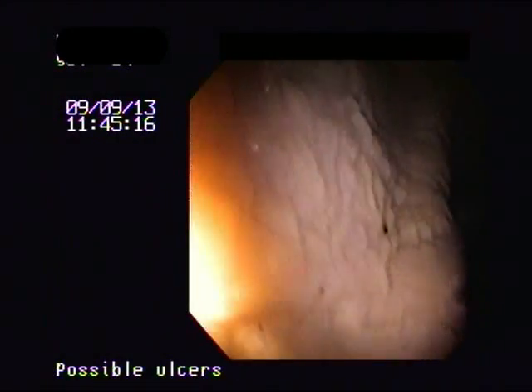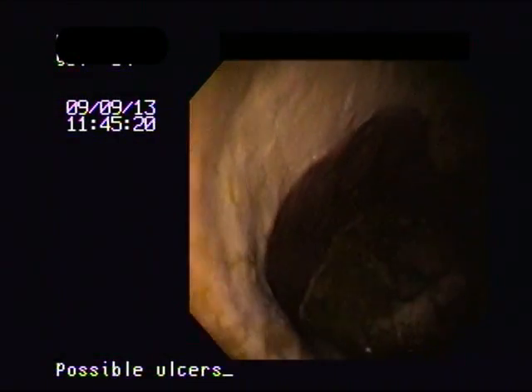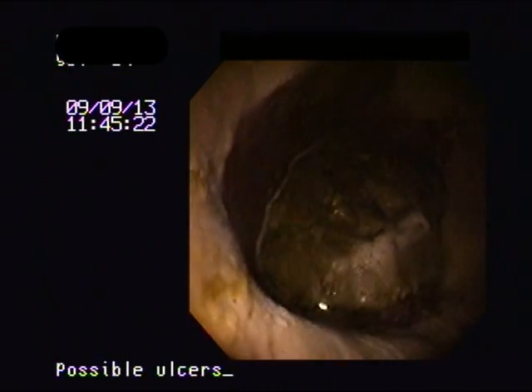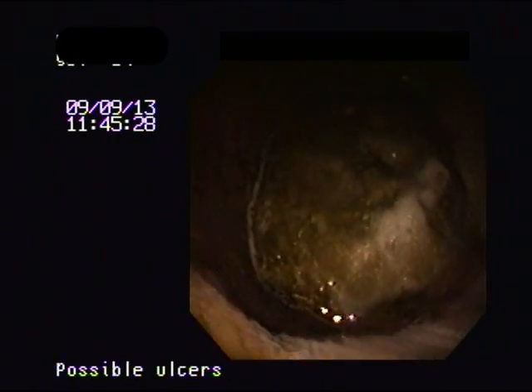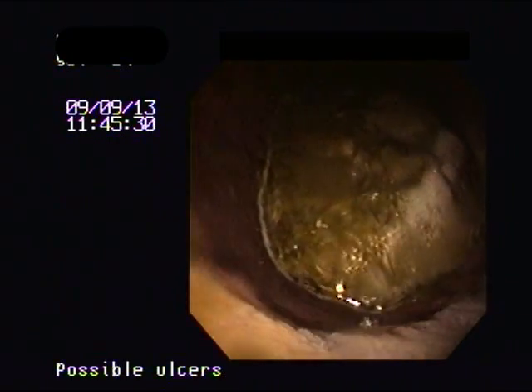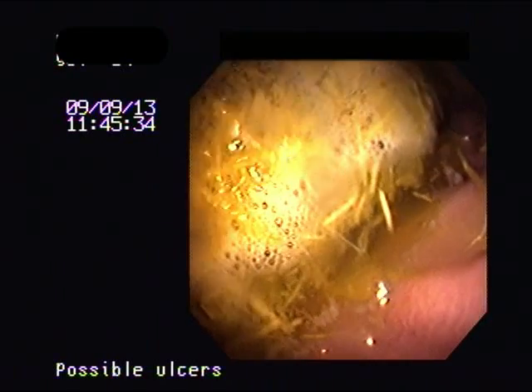This is to show you how we explore the mucosa close-up and personal. This particular horse has still some food material and a little bit of fluid in the stomach and we are going to take a dive to look for the exit of the stomach.